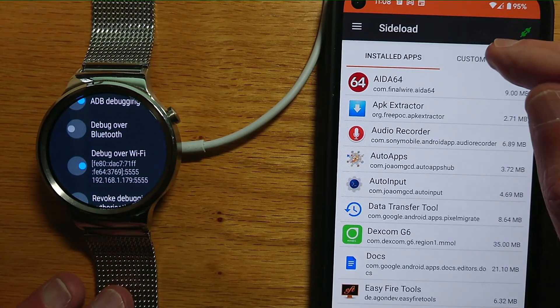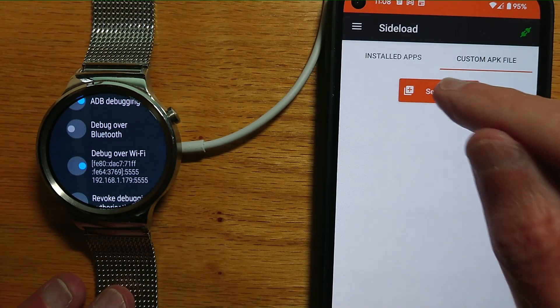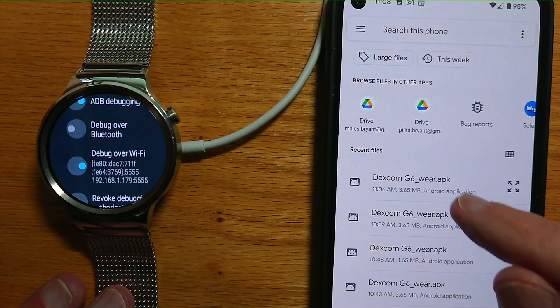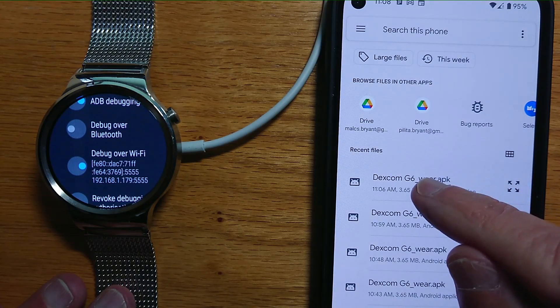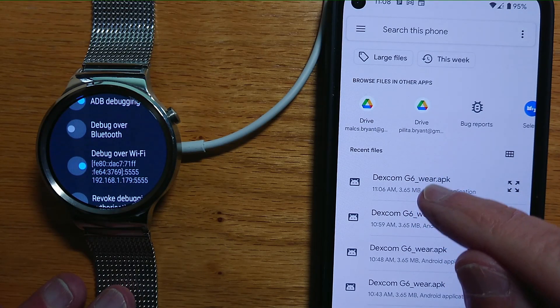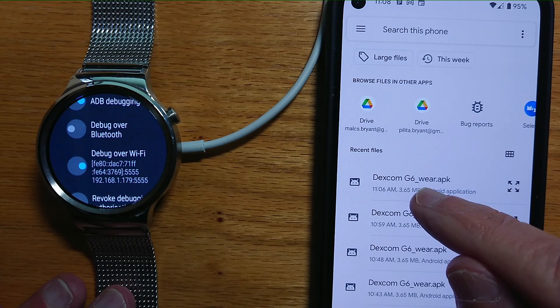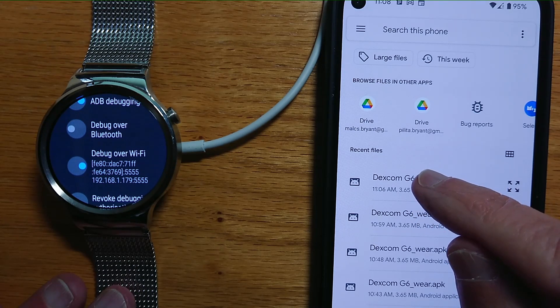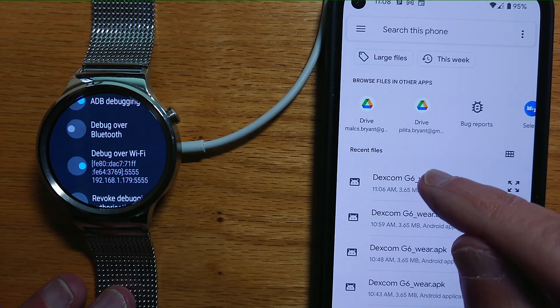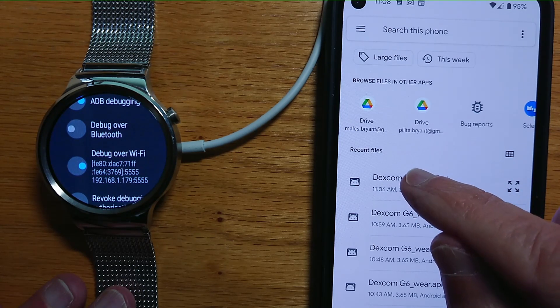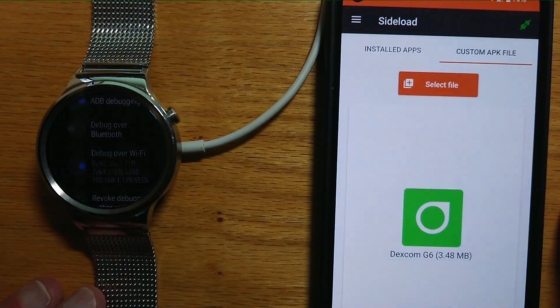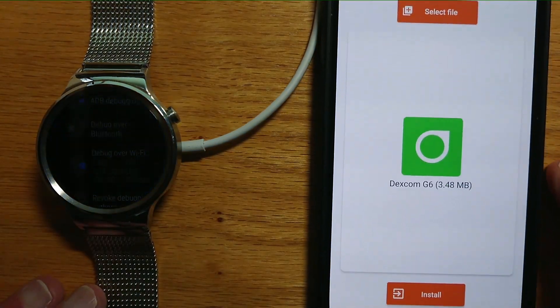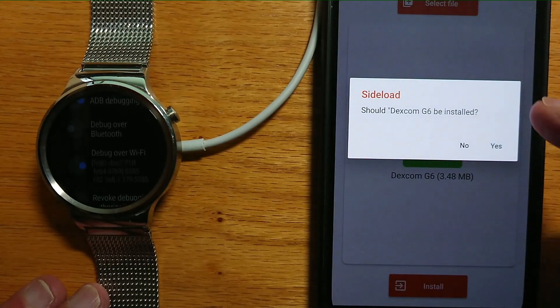So let's go to Custom APK File, select file, and you can see Dexcom G6 Wear.apk is there. That's the APK that WearInstaller put there a moment ago. Let's select that and select Install.